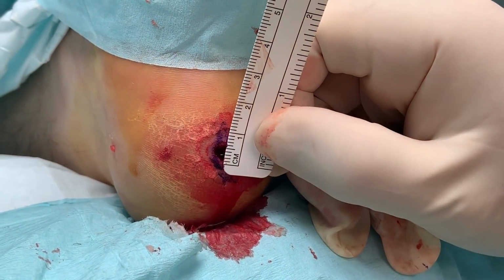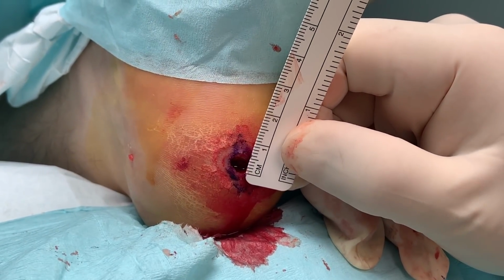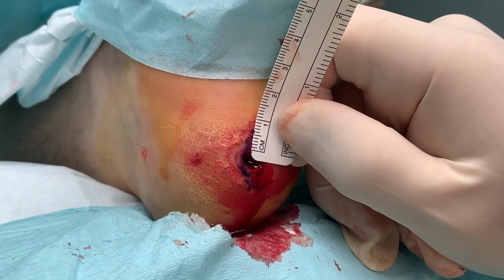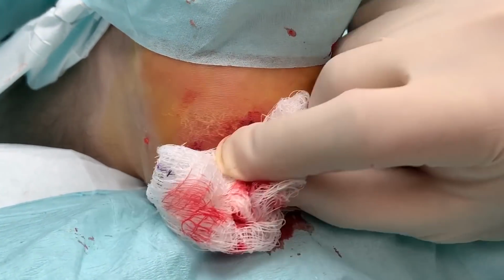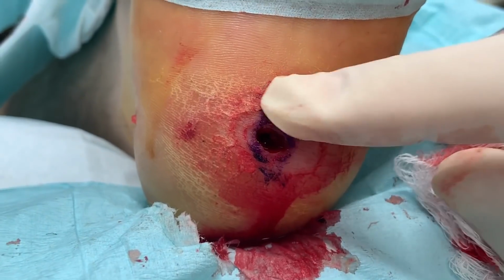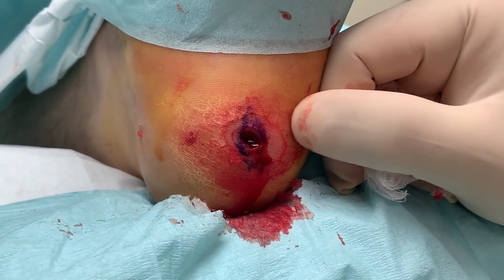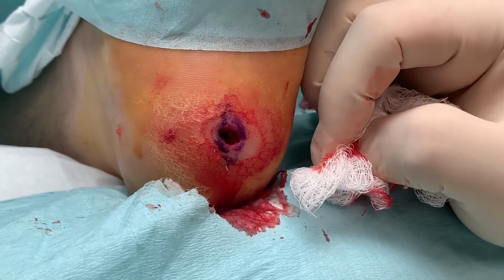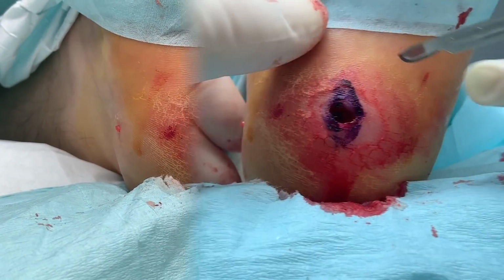We measured the wound out to be 0.6 centimeters. So the way we close wounds is you measure 0.6 centimeters out to the top and 0.6 centimeters out to the bottom, and then you can kind of see I made like a sideways eye. That way I have enough skin on both sides just to close it. So we're gonna cut it out, flush it out really well, and then close it, okay? Because we're sick and tired of this bad boy being open, and he's sick and tired of it too, so we're gonna cut it out.